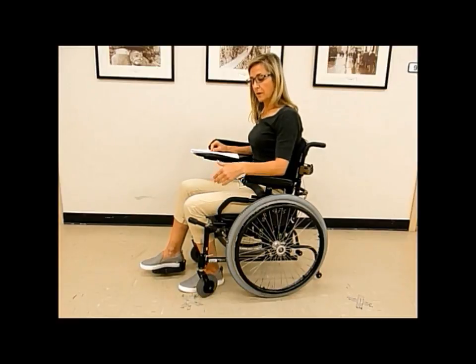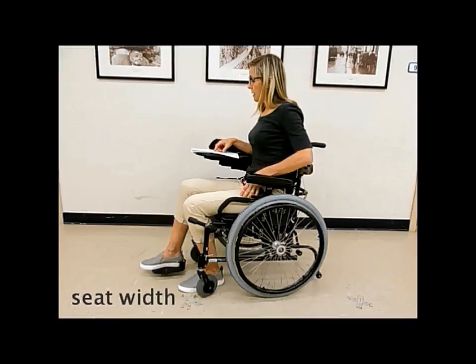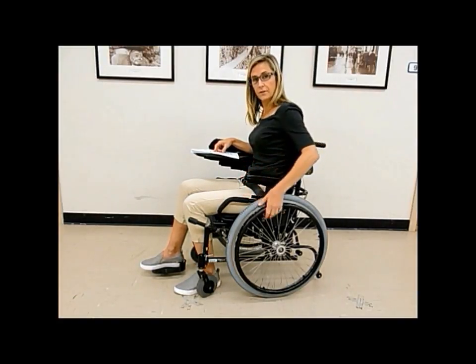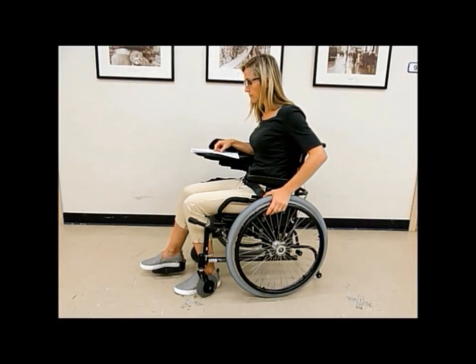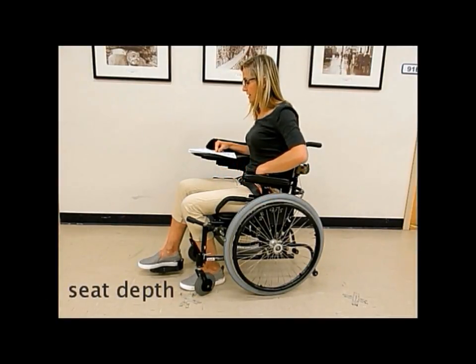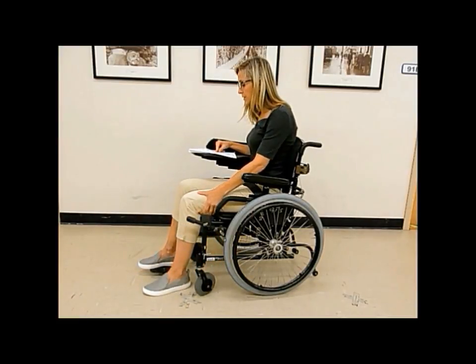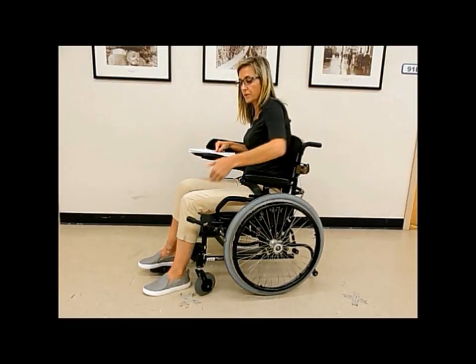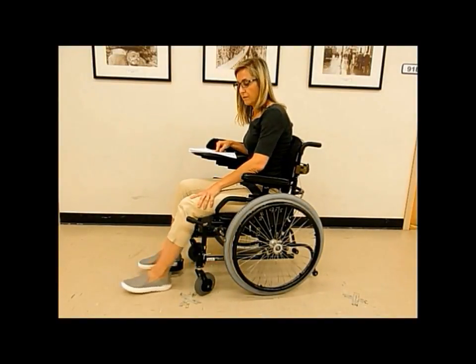So for example, the seat width. A tighter fit rather than a loose fit is better to give adequate lateral stability and also a closer access to the wheel rim. So keep the width as narrow as possible. For the seat depth, you'll require less depth to allow for enough clearance for foot propelling. A good starting point is about 4 inches shorter than your measurement from the buttocks to the popliteal fossa. This gives enough clearance for foot propelling.